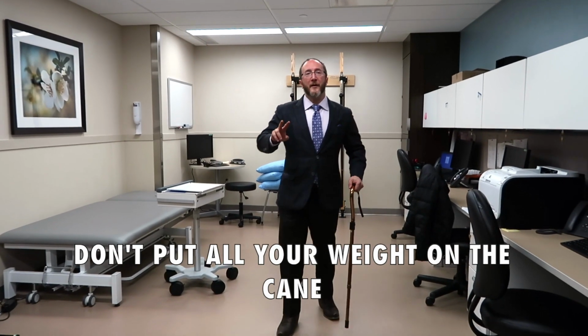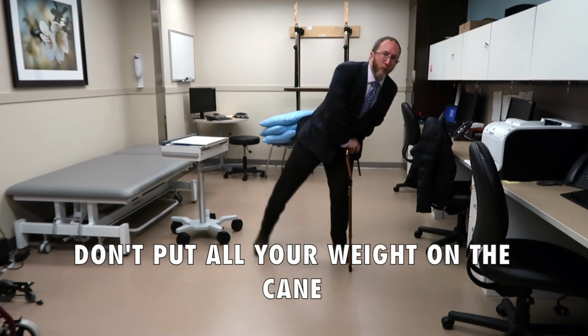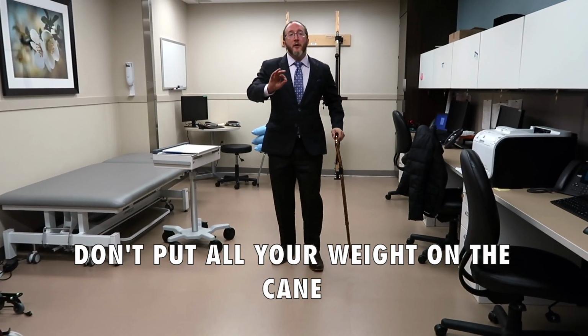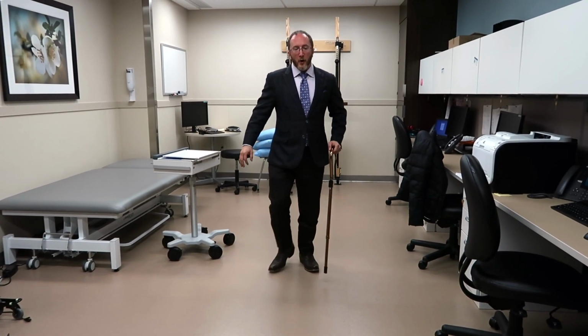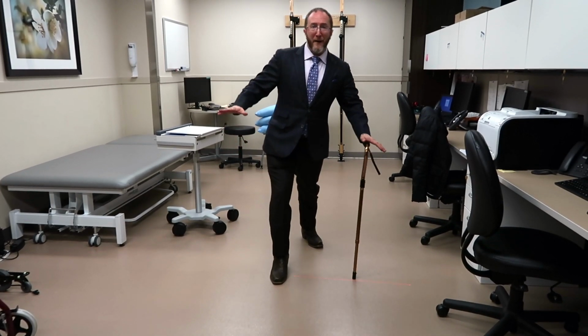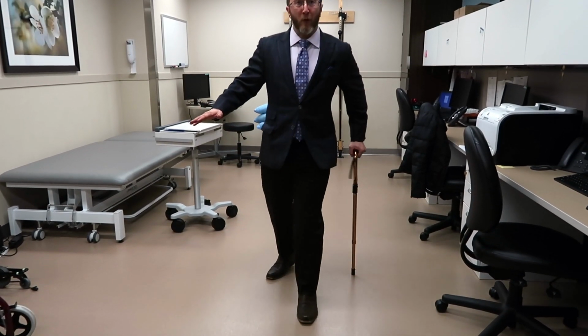The second tip is you don't want to put all of your weight on the cane. The goal is not to use the cane completely, but to use it as little as possible. You want to try to bear as much weight as you can here and really use the cane as a balance point and as a push-off point.